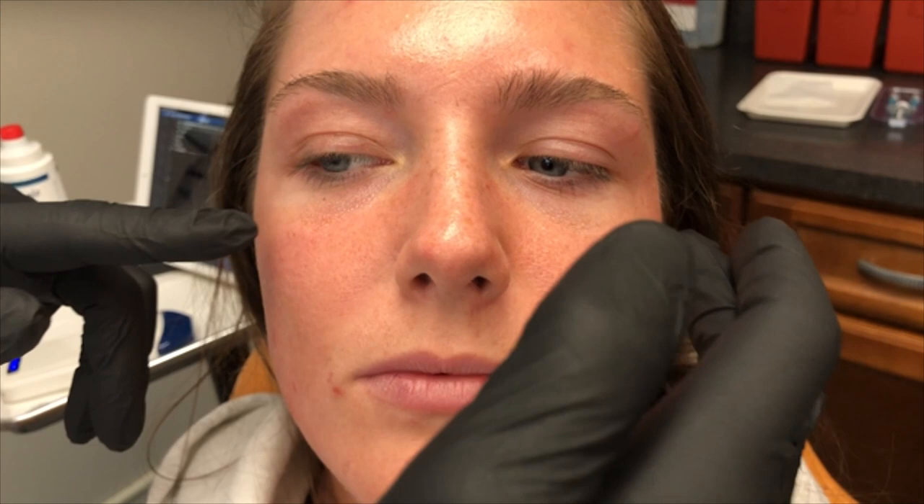Her treatment is going to be deep piriform fossa injections. She doesn't need the entire nasolabial fold — she just wants some volume right in here. In addition to that, we are going to do a very nice cheek enhancement. But we are going to first ultrasound the deep piriform space because that is really crucial. There is so much anatomy with the facial artery that can be superficial or deep, and this is the beauty of using an ultrasound like the WAVE-FE. It's quick anatomy mapping — we will see how deep and be able to measure where that facial artery is right in the area of injection, and that way we will know exactly how to inject on her.